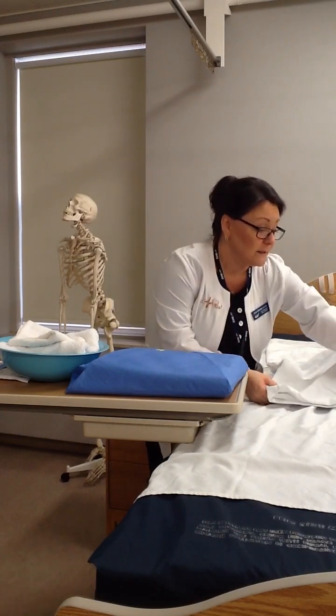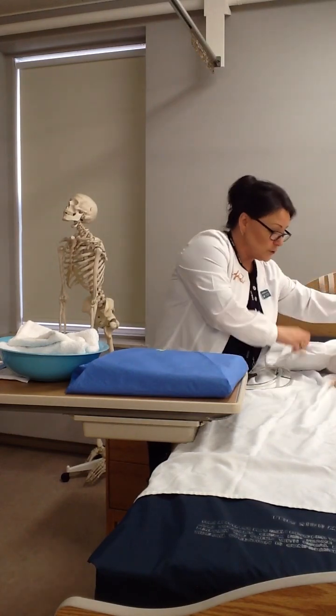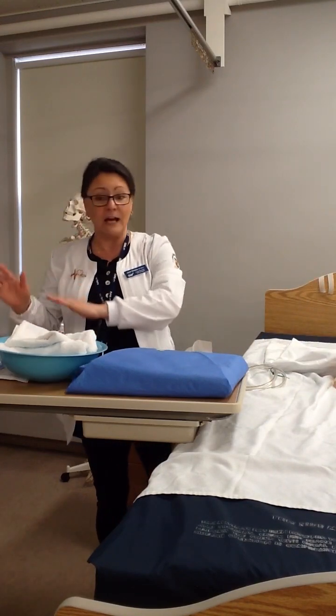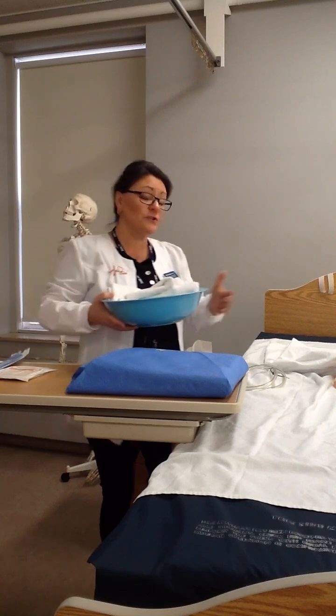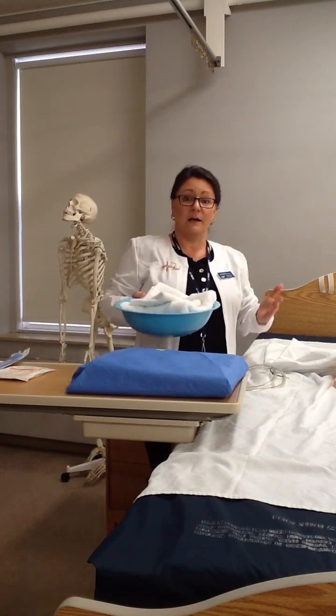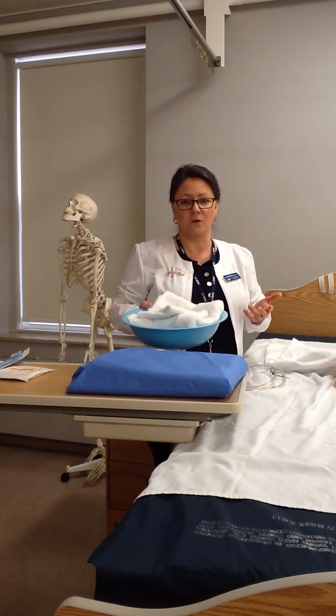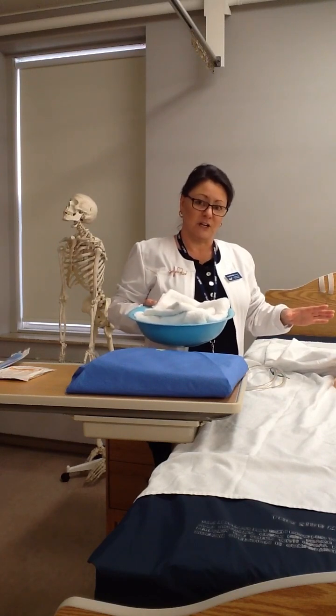So the next thing I'm going to do is, I'm ready to start my procedure. So I'm going to expose just the area that I need to. I'm going to apply a pair of clean gloves, and then I'm going to perform pericare on my patient. It's very important that we remove as much of the microbes that are on the genitalia as possible.